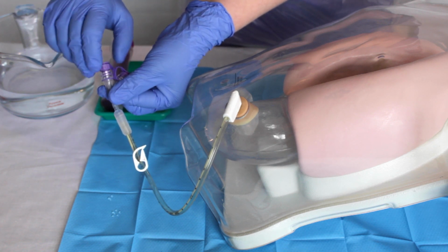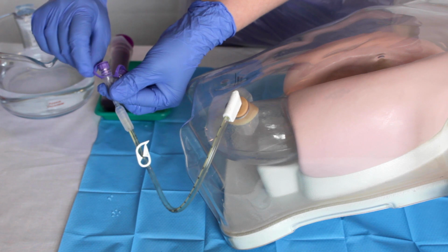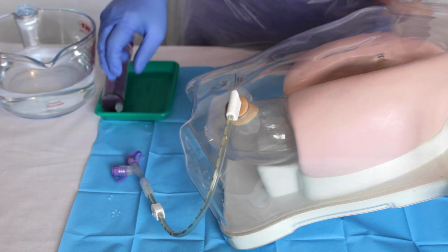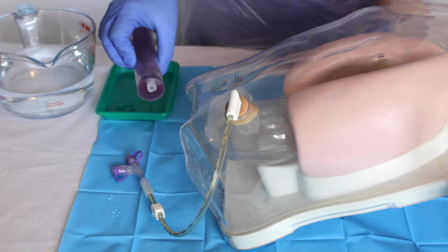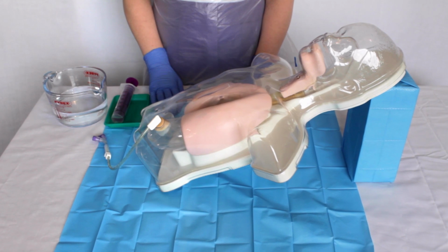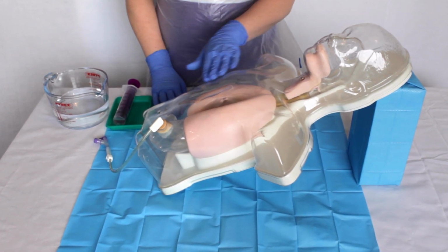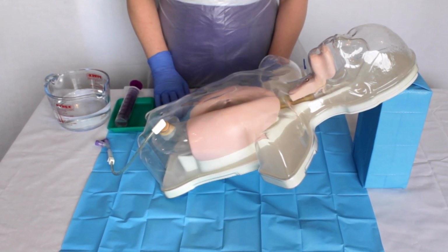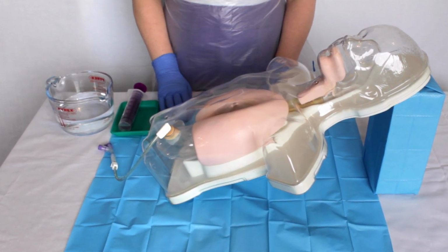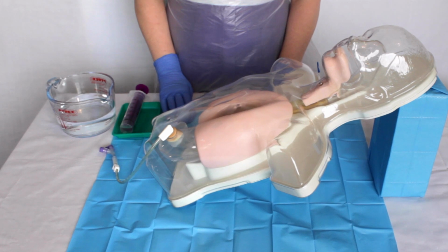Repeat these steps until the advised volume of water is administered and ensure to close the feeding cap. Wash and store syringes as per manufacturer guidelines and ensure the patient remains in a position of at least 30 to 45 degrees for 1 hour post-tube flush in order to prevent aspiration.